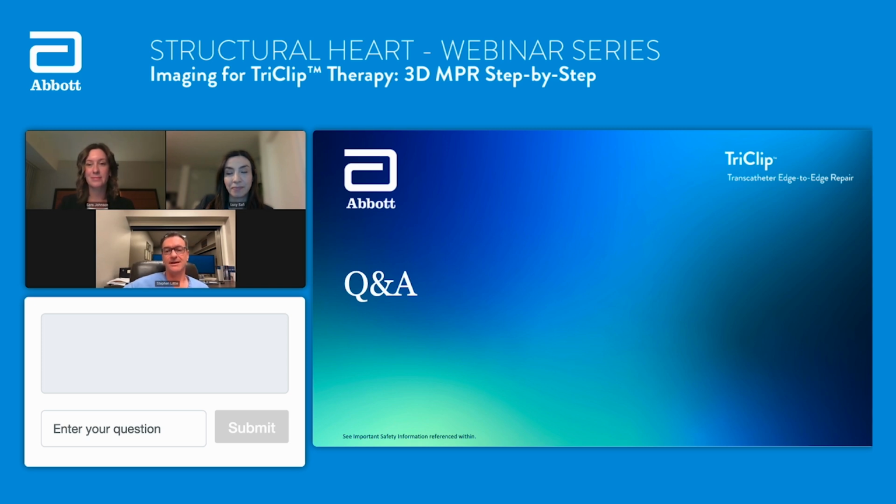You've got medial and lateral and anterior and posterior and short axis, and sometimes color all at once. But it's really worth the investment to do. I would just add one thing: once you've got it and it looks beautiful and it's incredibly useful, it sometimes does take a little maintenance.